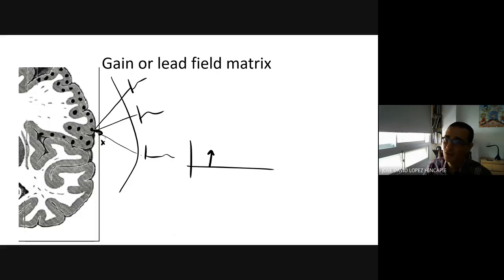If I duplicate the magnitude of that activity, given that the brain doesn't move, at least in short term, so if you are still, the brain doesn't change, the skull doesn't change, because we are talking about seconds, minutes, and the propagation goes almost at the speed of light, we will say that we will have twice the amplitude at the sensor. So this is linear. The problem of nonlinearity comes when you move your dipole, but we are not doing that.